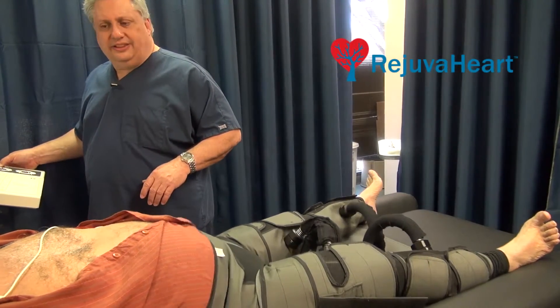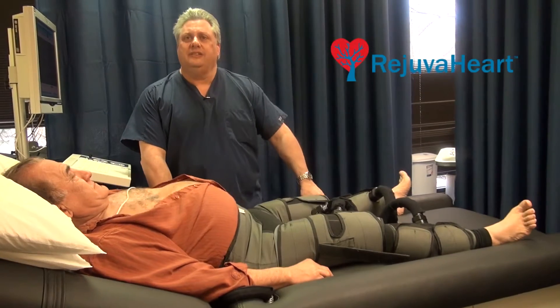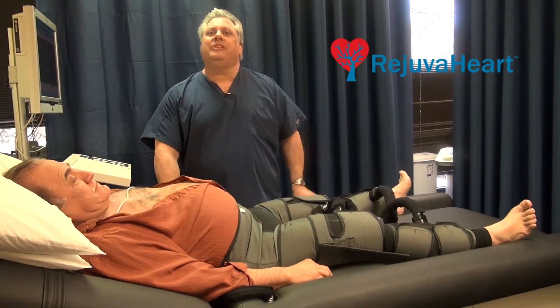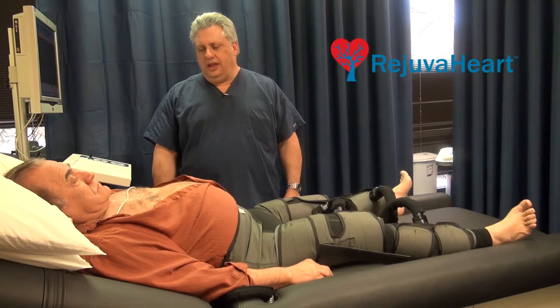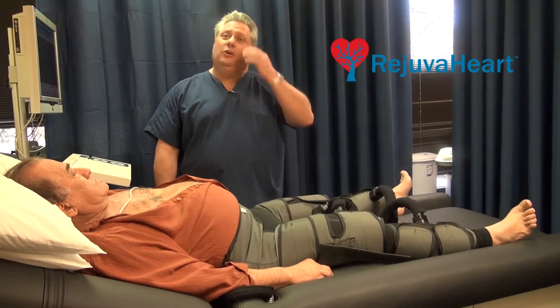Lying on a bed, the heart is timed. And when it goes into diastole — what I mean by diastole is relaxation of the heart — the blood is pumped.